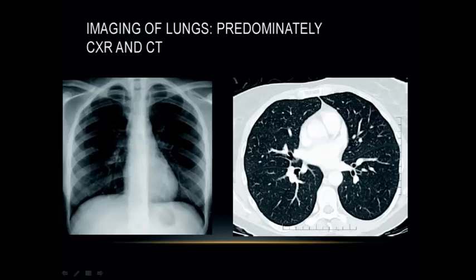So two options, conventional X-ray and CT or their combination, are predominantly used in diagnostics of the respiratory system.